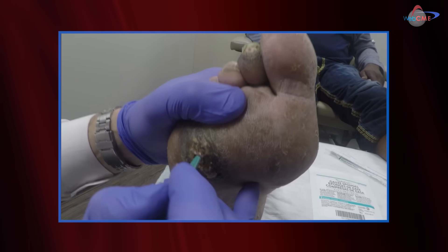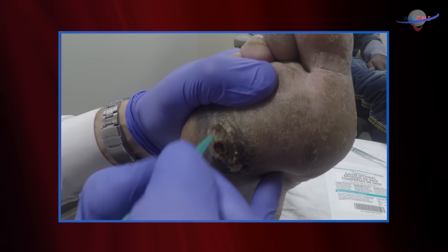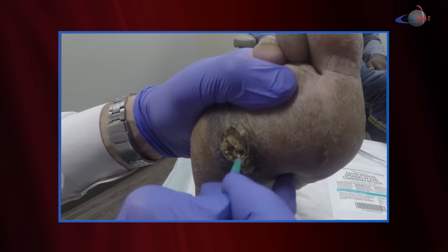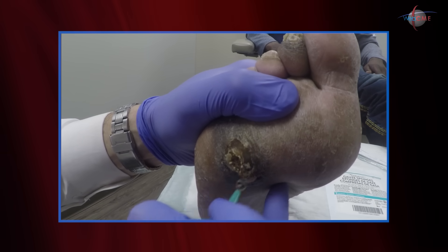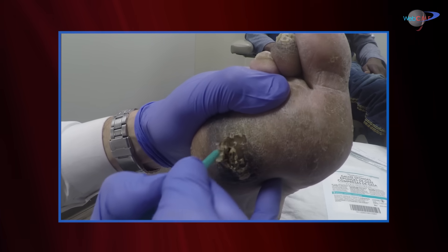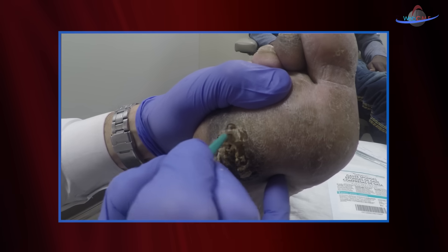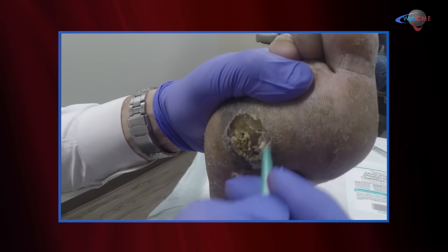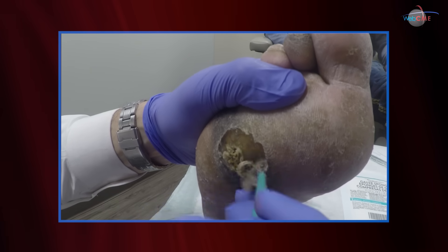I like to use a curette when I do my debridements. I use the curette because it is a very controllable instrument — it is sharp as a scalpel yet very controllable. Many folks will debride this type of callus with a scalpel, but I find that the control is less than optimal, less than desirable, and that's why I use a curette. I use a raking motion to take on the callus.